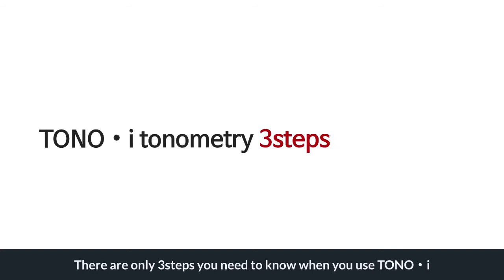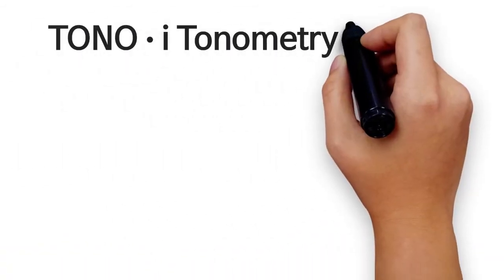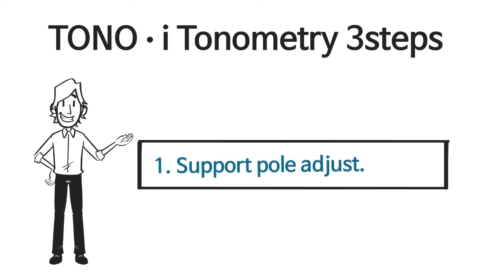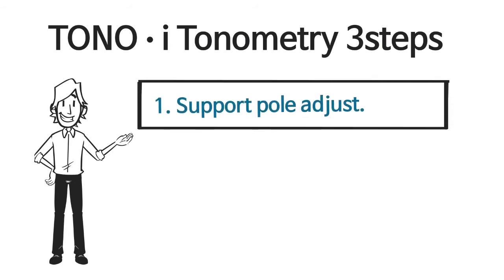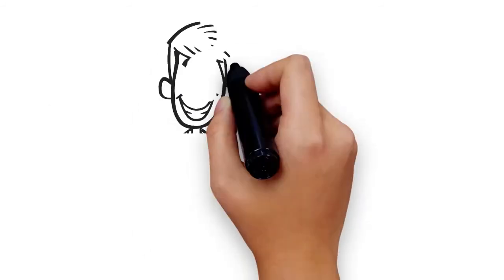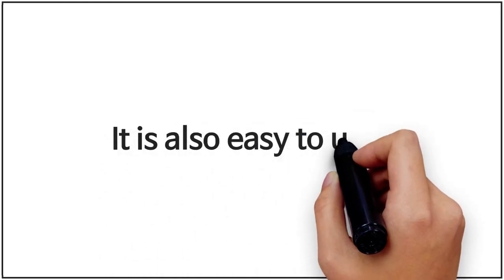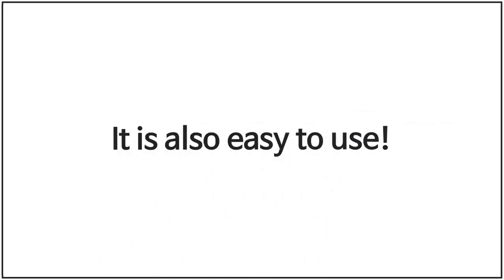There are only three steps you need to know when you use TonoEye. Step one: support pole adjust. Step two: air puff test. Step three: test the intraocular pressure. TonoEye — quite easy, isn't it? It is also easy to use. Let's see in detail.